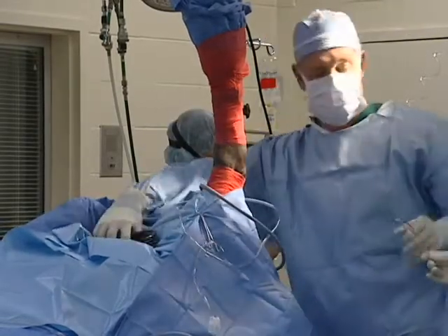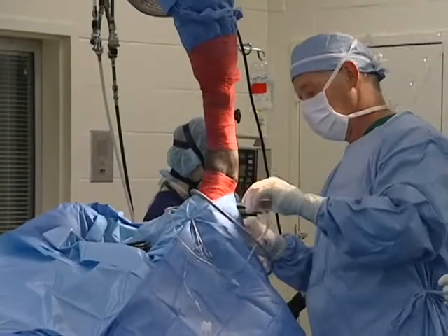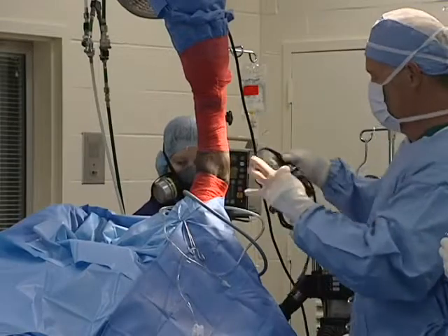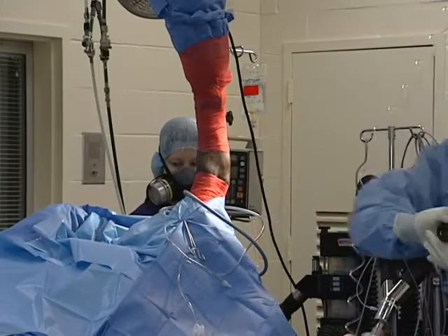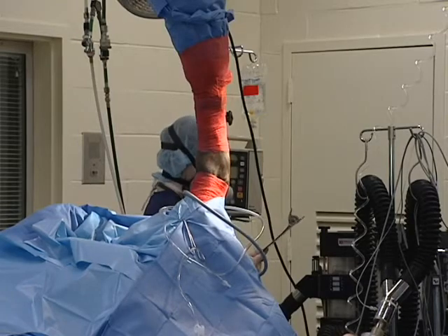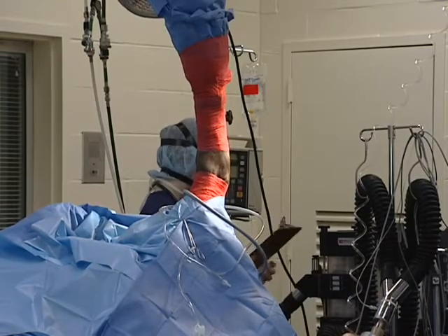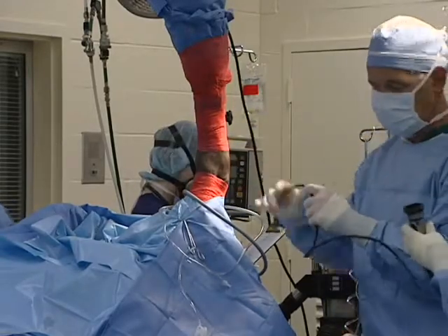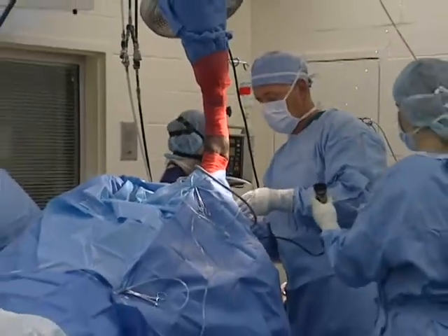So how is this similar to something that a human athlete would have done? Same type of surgery, same exact equipment, same thing that's used on people. Other than getting hoisted by the 1-ton lift. Right. Other than getting hoisted by the 1-ton lift, it's the exact same equipment, same training, everything. We just have to take a little bit more precaution because our patients are a little bit bigger.